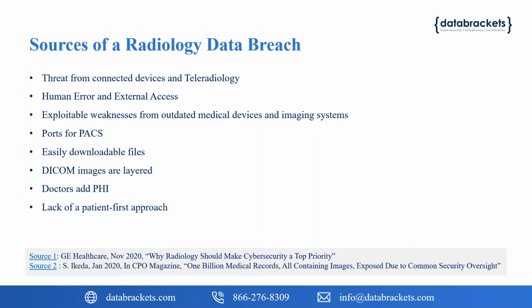Let's look at where some of these sources of the data breaches are coming from. Most of these DICOM servers are all connected. Images are created and stored in the PACS server, and then they need to be accessed, one by your radiologist, one by your referring physicians, and one by your patient. And then there are so many other providers who want access to these images for billing purposes, for treatment purposes, and for operation purposes. So if they need to be accessed, of course they need to be connected.